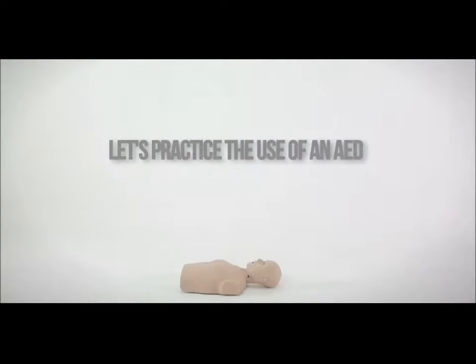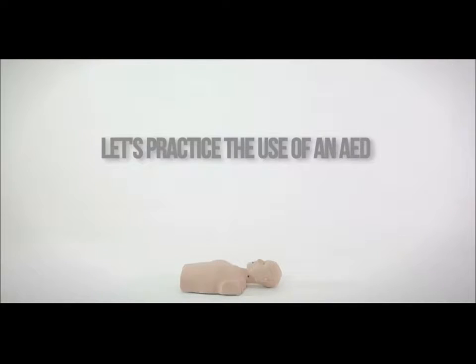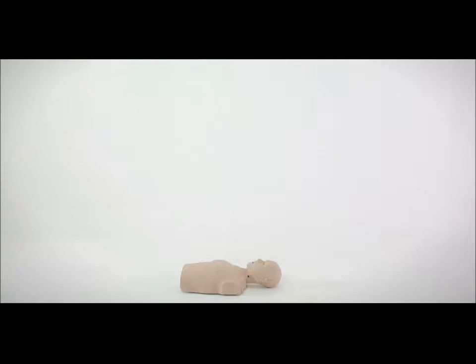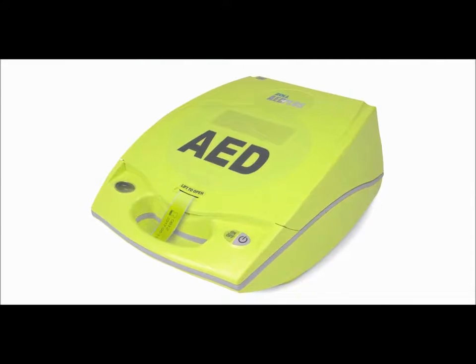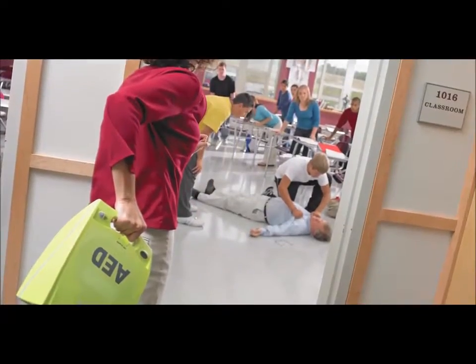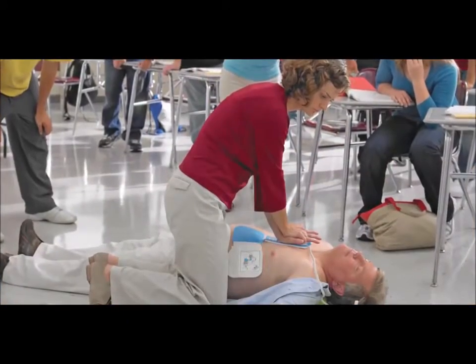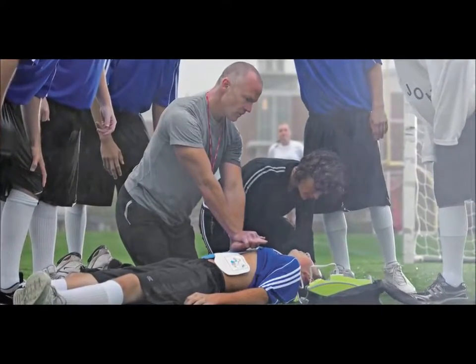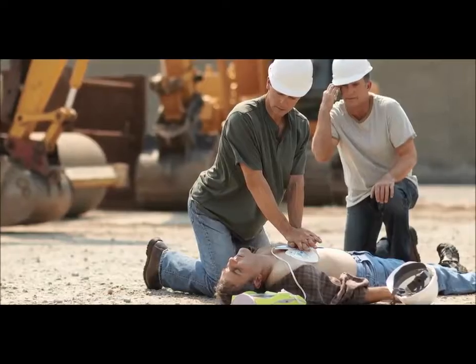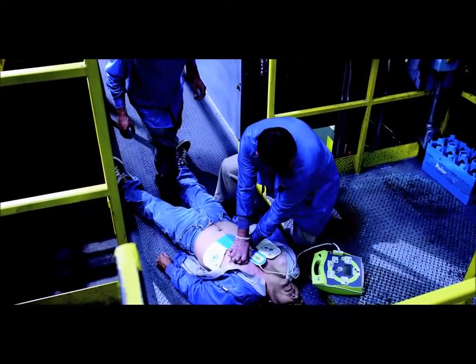Next up, we will practice the use of an AED that has CPR feedback technology. In this scenario, we are using the Zoll AED+. AEDs with real-time CPR feedback technology give lay rescuers the confidence they need to save lives, while helping rescuers avoid the most common mistakes made during CPR: insufficient chest compression depth and rate.